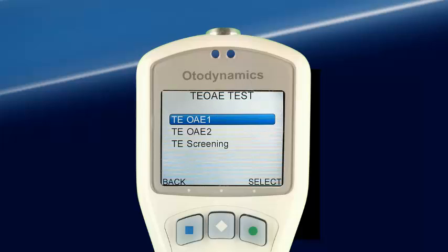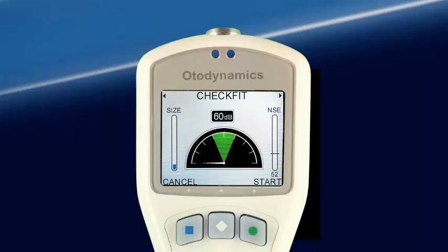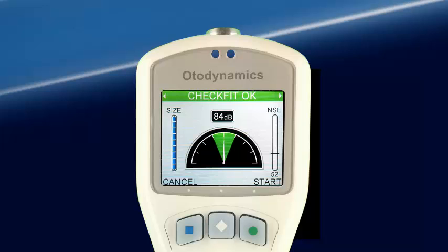Selecting Test will bring us to the TE-OAE Test Selection screen. For this demonstration, we will select the TE-OAE1 protocol. Pressing Select brings up the CheckFit screen, which is used to assess the testing environment before starting the test.